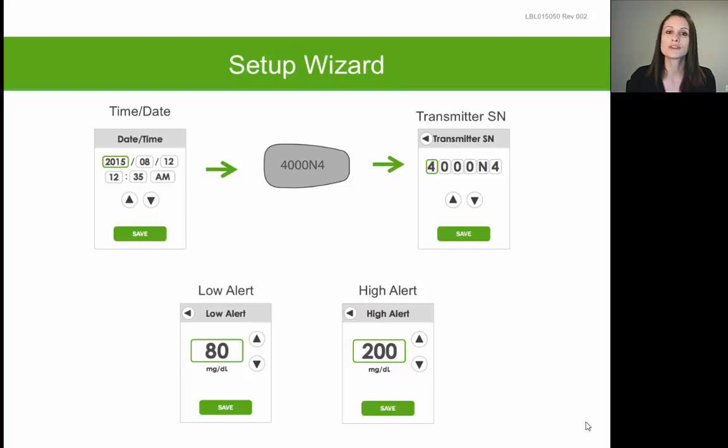Once you've entered your transmitter serial number, the receiver will ask you to set your low and high alerts — the level at which you want to be alerted for a high or low glucose. When setting your low alert, you may want to consider setting it slightly higher than what you consider a hypoglycemic episode to be, to ensure the Dexcom alerts you at the beginning of that episode before it gets too severe. When setting your high alert, some people set it at the upper limit of their target range, such as 180 or 200, while others set it higher — for example, at a level where they might take a correction dose of insulin.